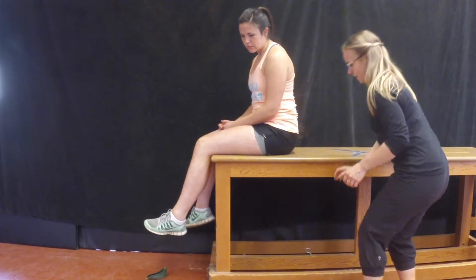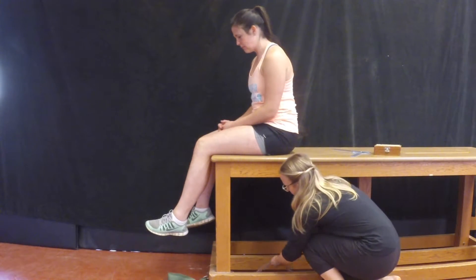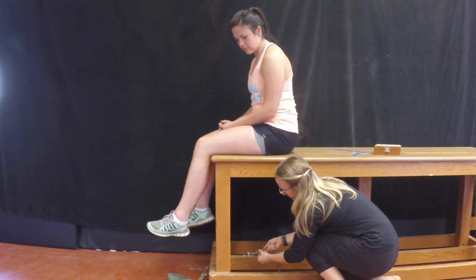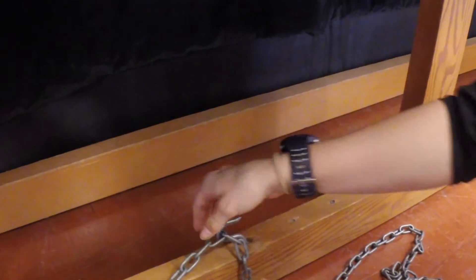Then attach the chain end of the cable around a hook under the table. Here's a tip: knowing how many chain links results in the appropriate cable length can help make the setup a lot easier.